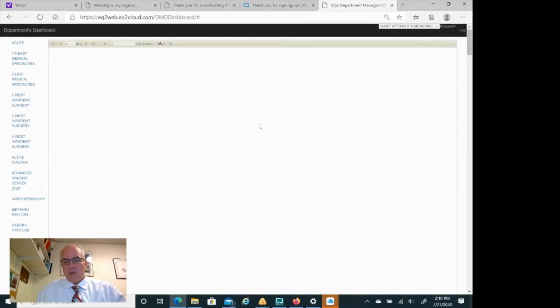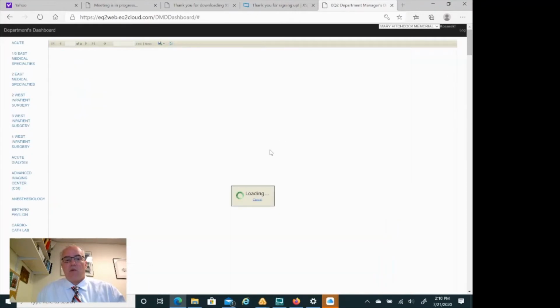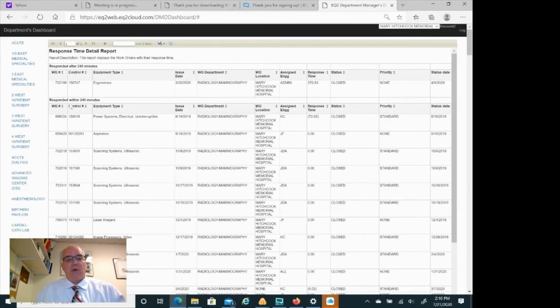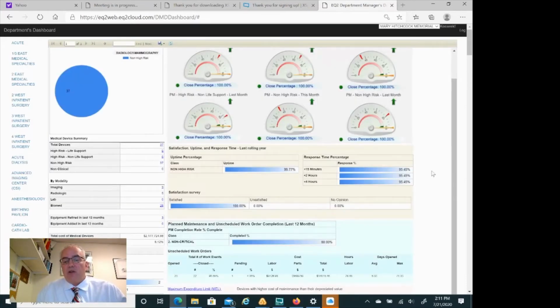So that's pretty good. But I, as a manager of a department, can actually go in here and look at all of these. I can even look at the 4-hour one, which ones responded. These were responded within 240 minutes. So this captures all of the things that were in the 15-minute, the 2-hour, and the 4-hour. But it does tell me that we had one that was over 240 minutes. So that would be something that I would go look at as a practice manager. I might ask some questions about it, as well as an HTM manager. I might want to look into that as well.